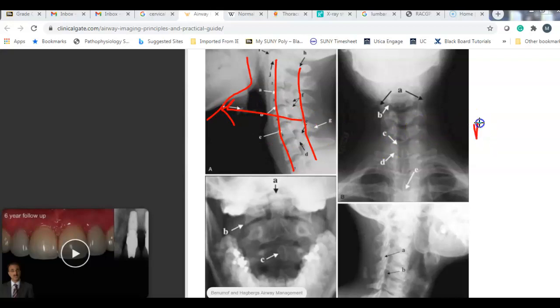PA or AP view depends on which way the x-rays go through that patient. So if the patient is facing the x-ray machine, their back is against the bucky. The bucky is what we used to call it. Once again, I have old terms, but it is what controls or contains the film. If the x-rays go from the anterior to the posterior of the student, it's an AP view. If you want the chest film, you want the lungs closest to the film, you would do what's called a PA view. Okay, so it depends on which way the x-rays pass through.